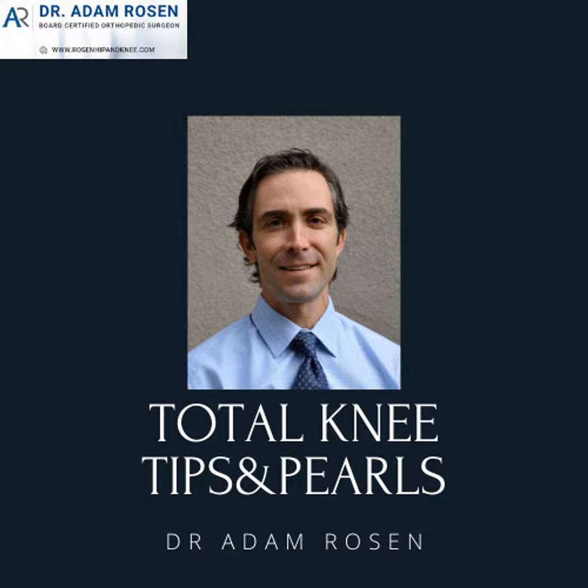But notoriously, when you go into a revision, everything is scarred down. So by making that incision a little bit proximal and distal, what I find at that point is I can better identify the healthy virgin tissue. And at this point, then I know the depth of what I'm aiming for.